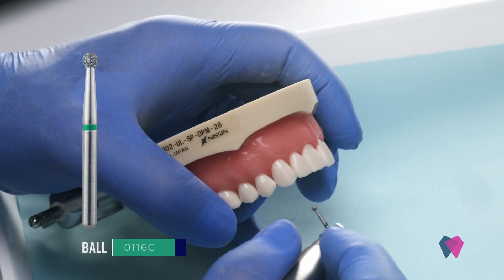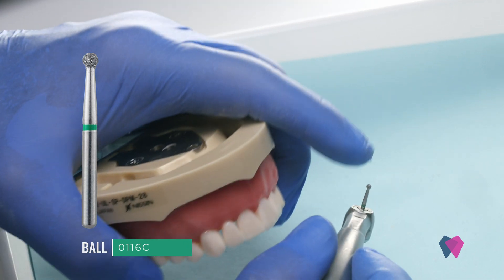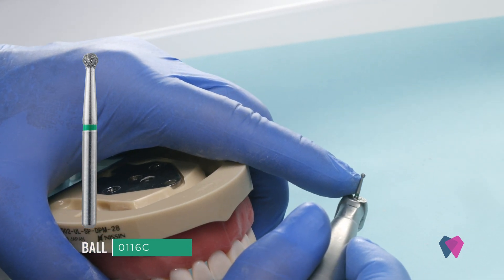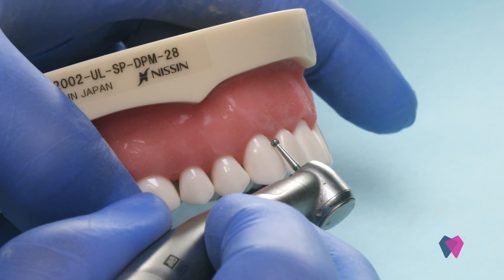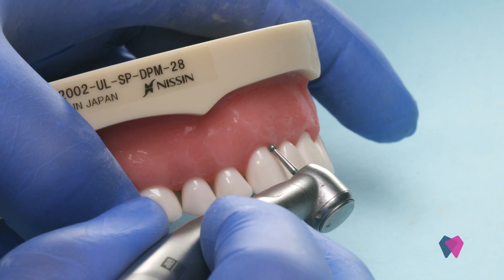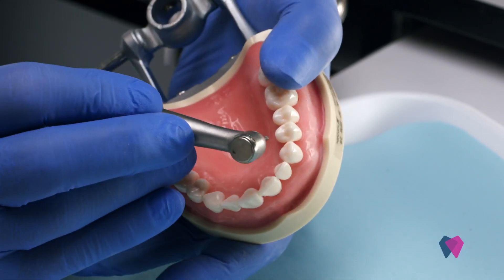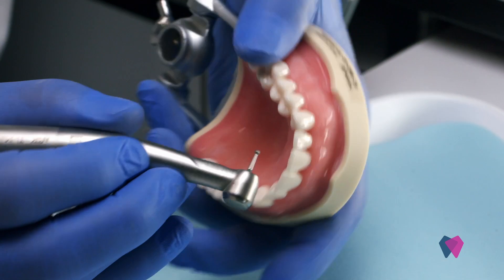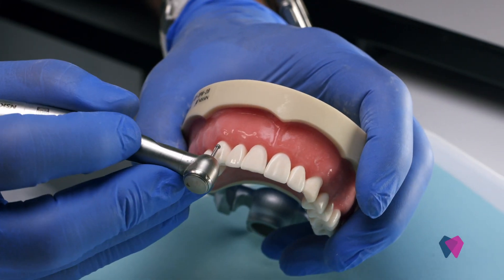With an anterior crown preparation, we're going to go back to using our ball diamond. It's 1.5 millimeters thick, so we just want about a half a millimeter or 0.7 millimeters going all the way around the margin. We'll go up the incisal edge and over to the lingual surface, and that's going to give us our depth cut. So let's go ahead and place that for now.